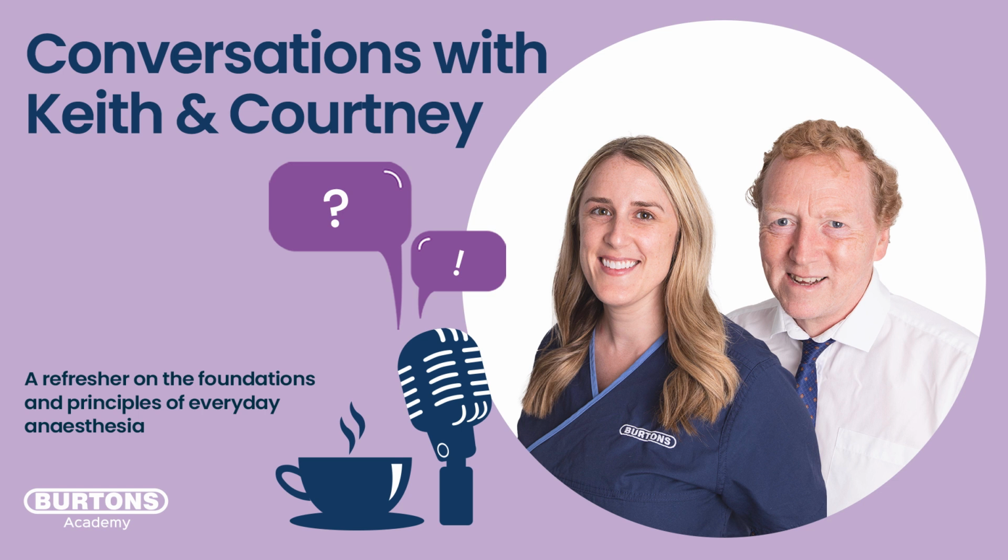So I think we may have slated the pulse ox. But it's great. It does have its place, but it certainly has its limitations. I think that's recognised in the medical field. They don't rely that heavily on it. It's a really good guide. Obviously, during COVID, it was a really good indicator, because COVID was a condition which really led to diffusion limiting of oxygen. We talked about that before. So that was a really good indicator.